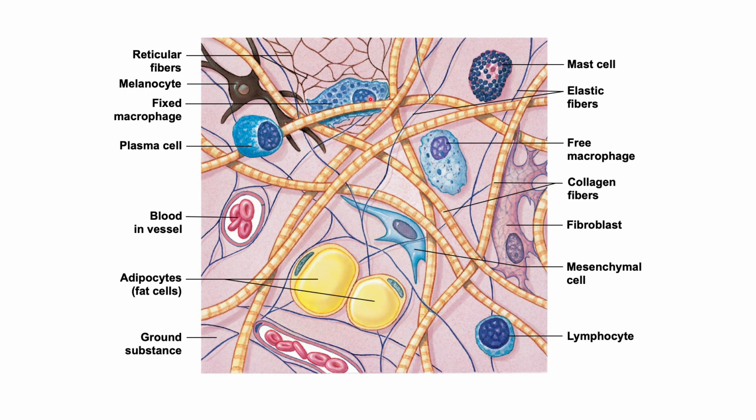And then we're going to see another obvious thing, this brownish, yellowish thing that looks like stripes. These are collagen fibers. Most people would think, oh, collagen in your skin, but I always say, hey, collagen is in connective tissue. And obviously, when we get to the integumentary chapter, we're going to be talking about collagen fibers as well. Like I said, some of these connective tissues will have more than others, right?